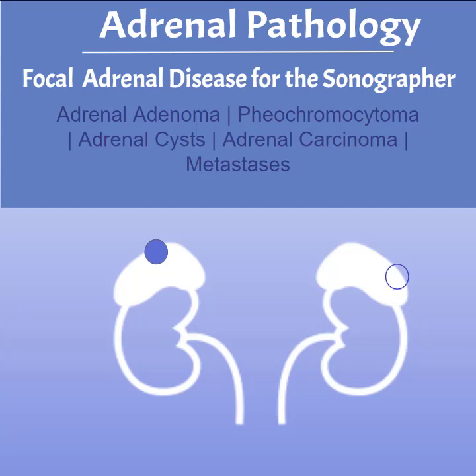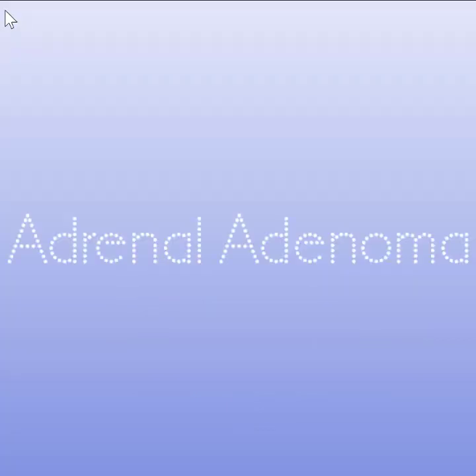Welcome to our sonography lecture on adrenal pathology, part 2 of 2, focal adrenal disease for the sonographer. This lecture will cover adrenal adenoma, pheochromocytoma, adrenal cysts, adrenal carcinoma, and metastases. Let's go ahead and begin then with adrenal adenoma.